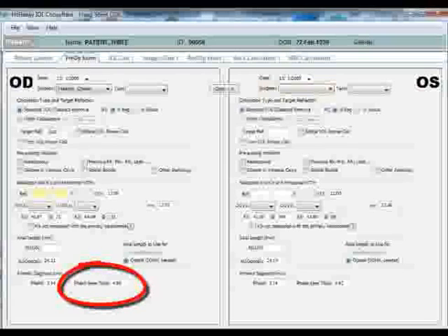The aqueous depth is measured from the endothelial layer of the cornea to the anterior surface of the lens.